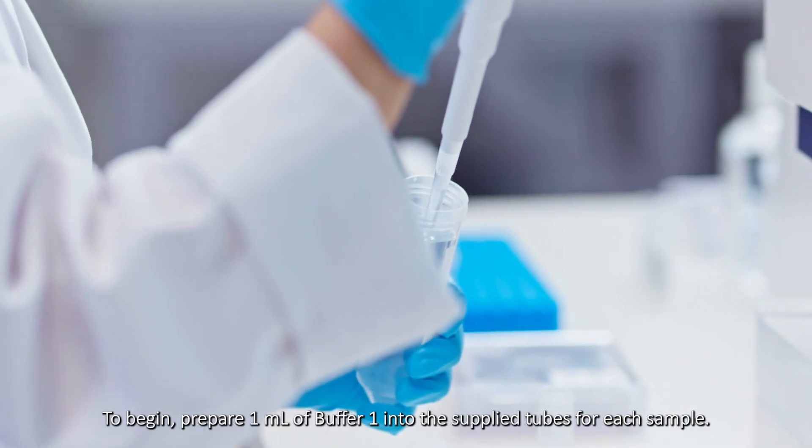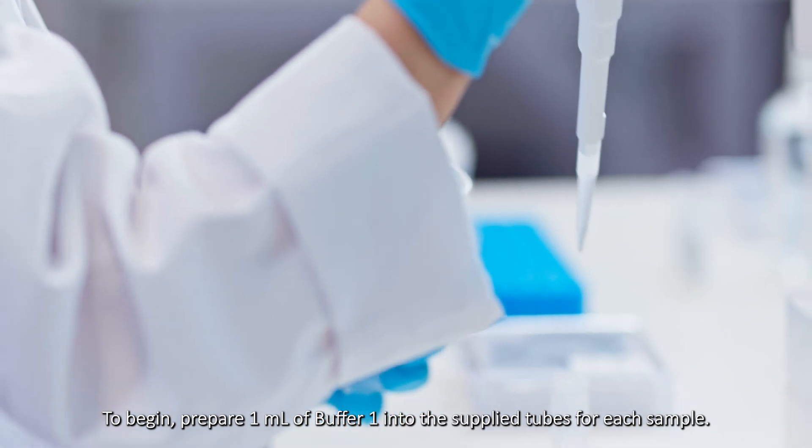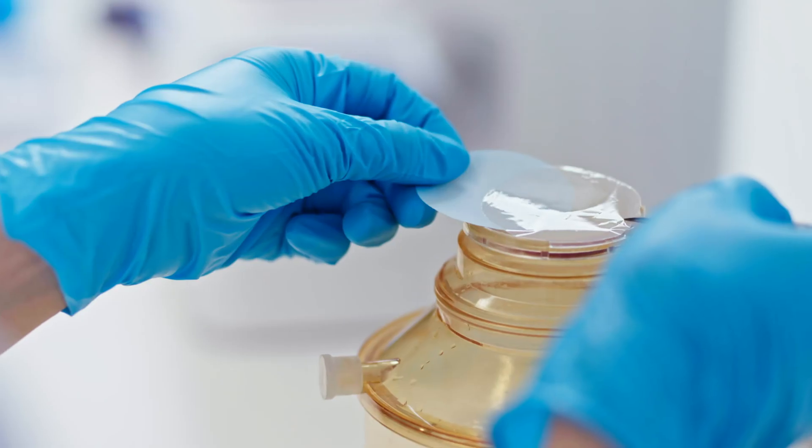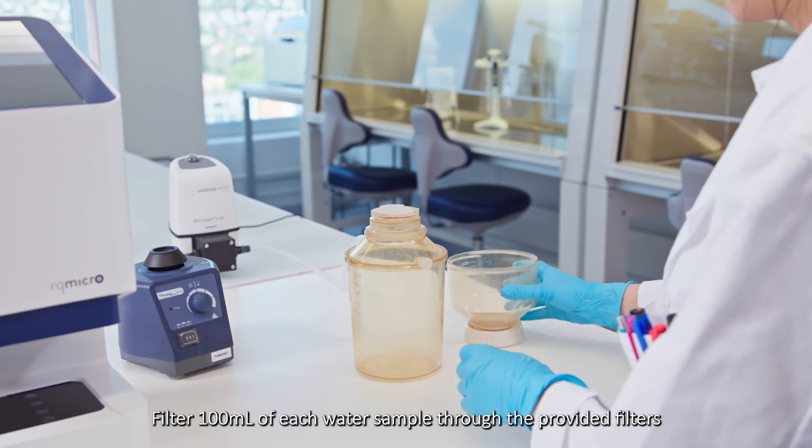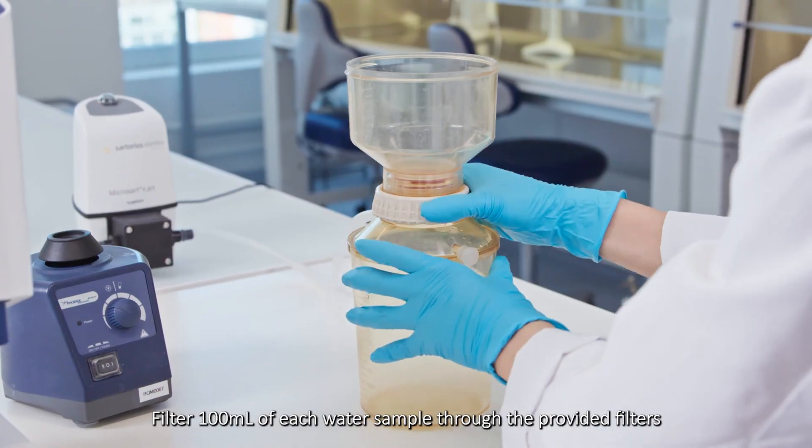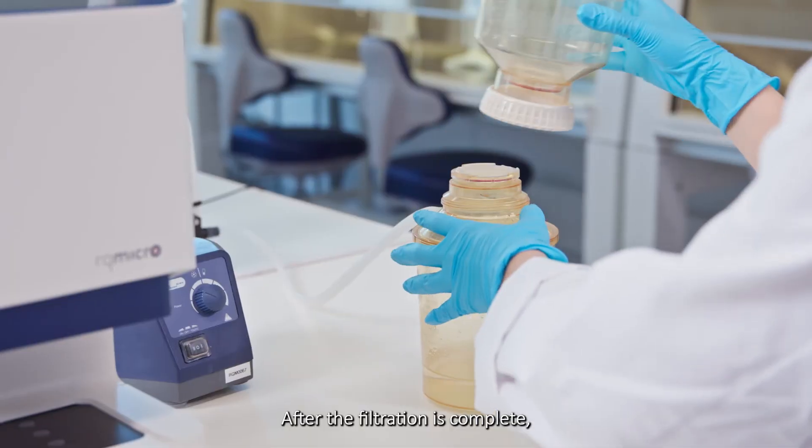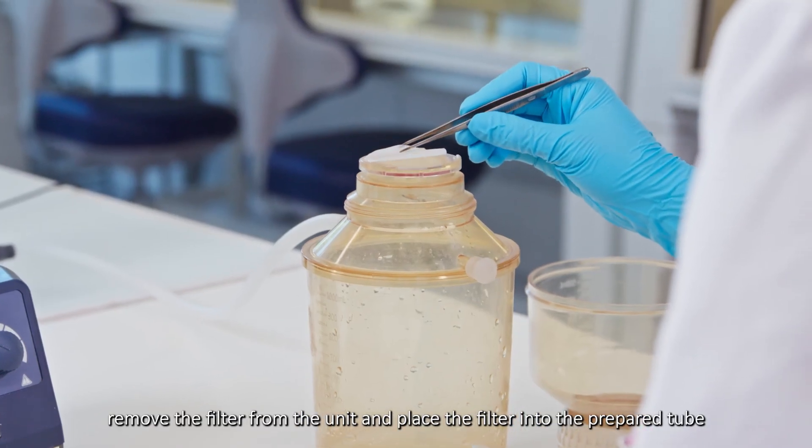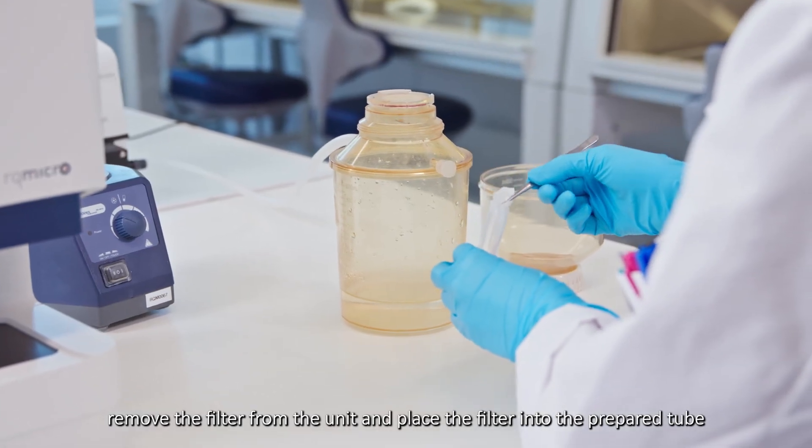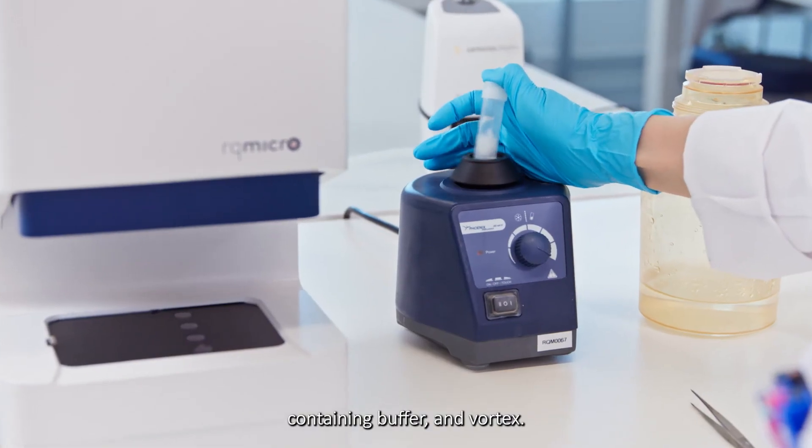To begin, prepare one milliliter of buffer 1 into the supplied tubes for each sample. Filter 100 milliliters of each water sample through the provided filters using a vacuum filtration unit. After the filtration is complete, remove the filter from the unit and place the filter into the prepared tube containing buffer and vortex.